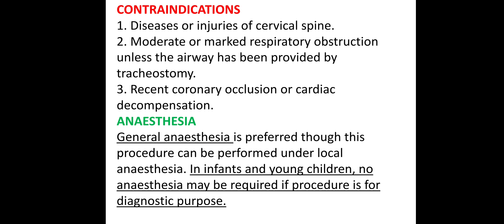Contraindications include diseases or injuries of the cervical spine, moderate or marked respiratory obstruction unless the airway has been provided by tracheostomy, and recent coronary occlusion or cardiac decompensation.